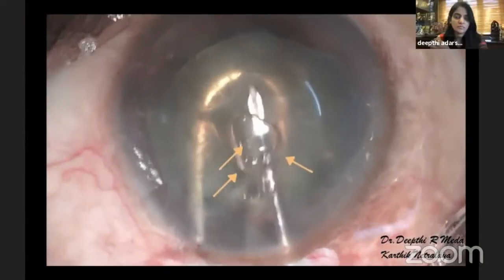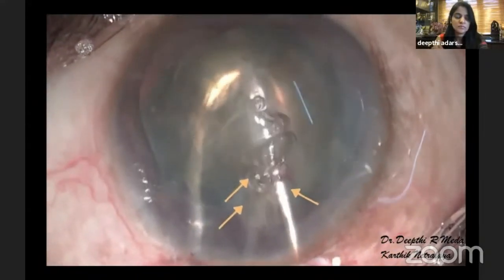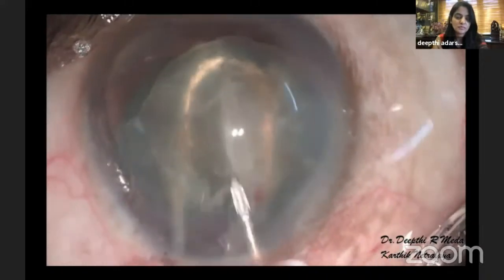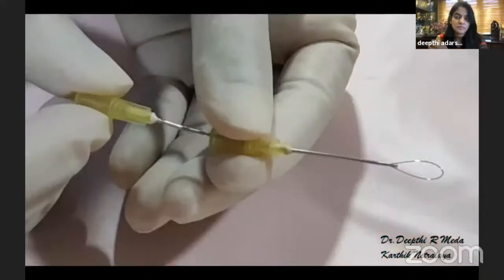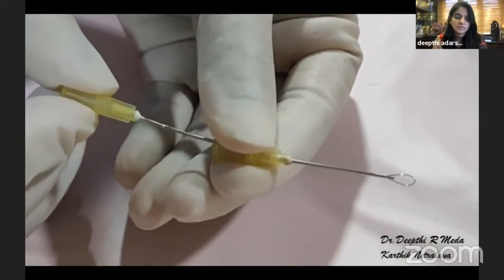Again, as we see in this recap, the air bubbles demonstrate how the cystitome is continuously injecting visco to coat the endothelium and also to maintain a safe space in between the nucleus and the endothelium. So in the third case, we use a snare.